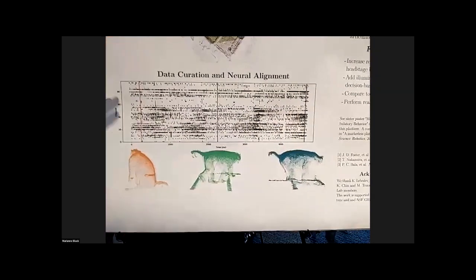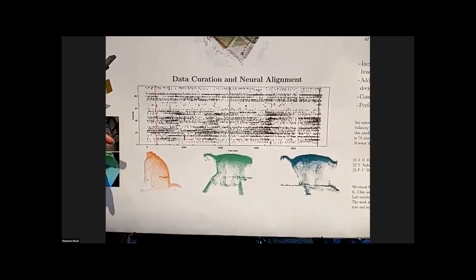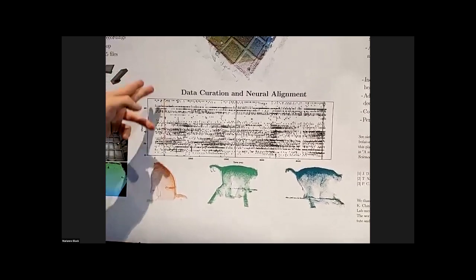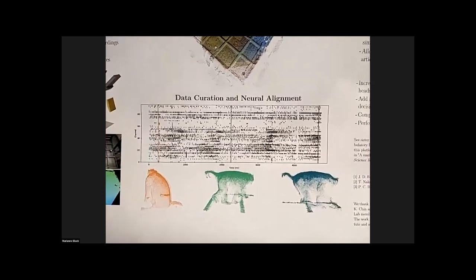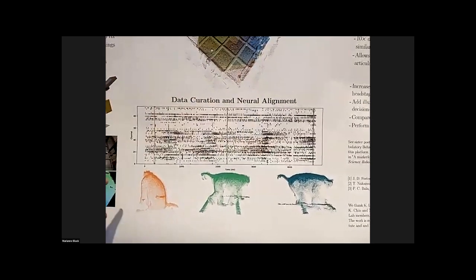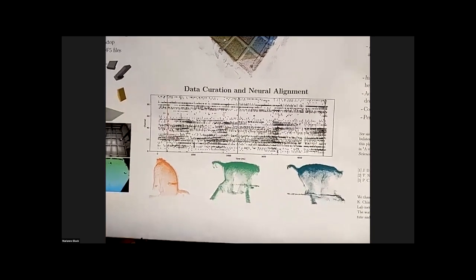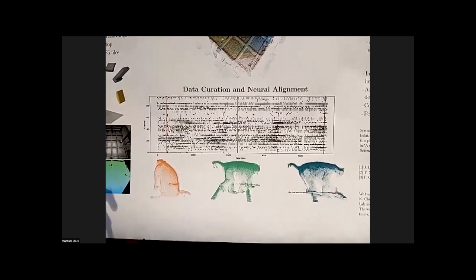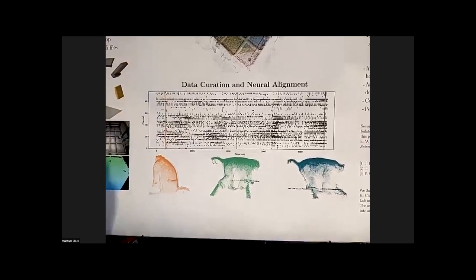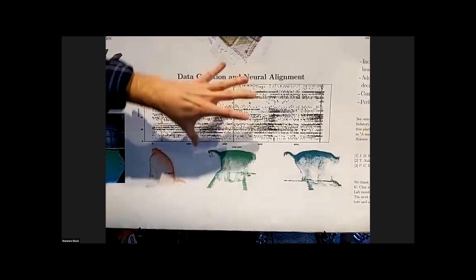Here you have a spike raster. This is from the implanted electrode array in the animal. Each channel is detecting spiking activity from a neuron, and each vertical line represents a spike in time, so a neuron firing. So you have channels and then spikes over time. We can align that with the animal's motion as it moves. As we conduct future experiments, we will be quantifying this motion and seeing how neural activity is affected, and then hopefully at one point be able to decode movement from just the neural activity.